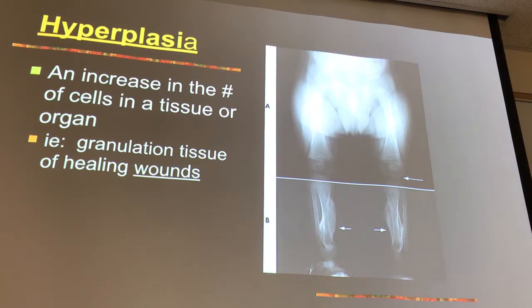What's 50%? What did Raphael tell you about 50%? Is that how much you have to increase it to increase the dose, for a repeat? Right? 50% is to repeat, correct? So if you think you have to go double, you've got to repeat. 30% is what our eye sees. Radiologists, I guess, can see 20. I don't see 20. I can see 30 though. So you're going to change by 30.